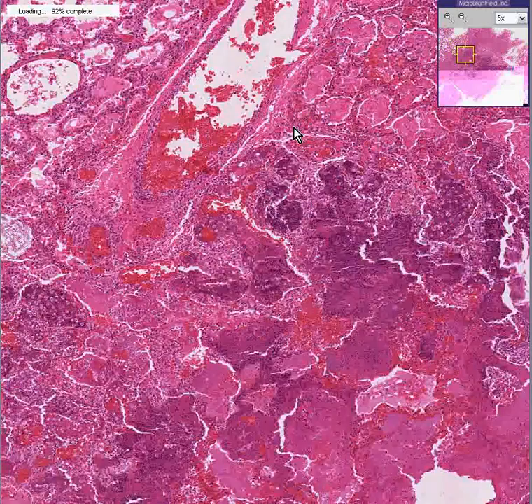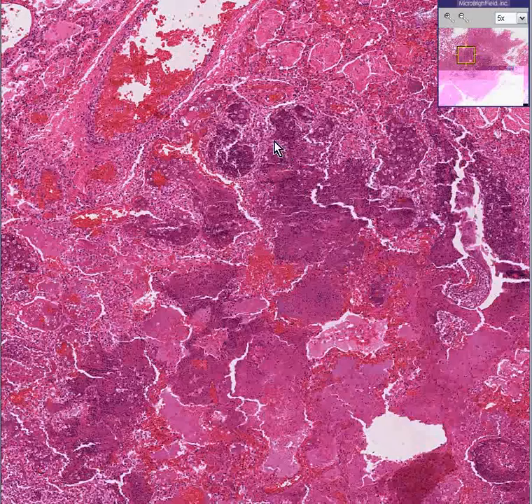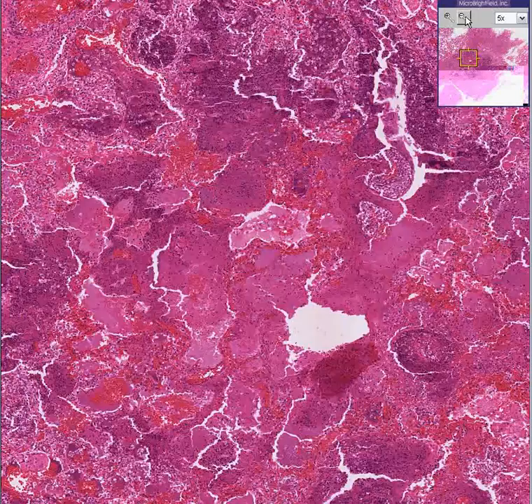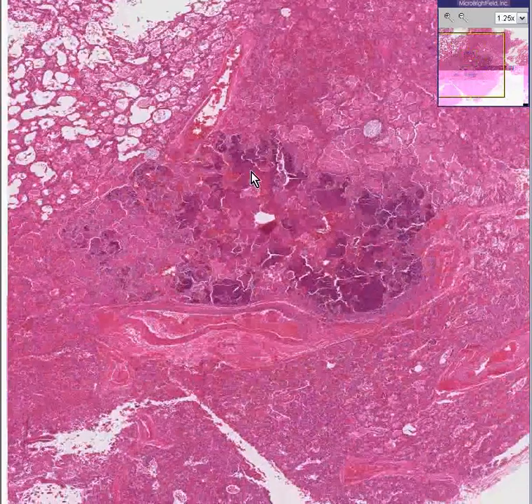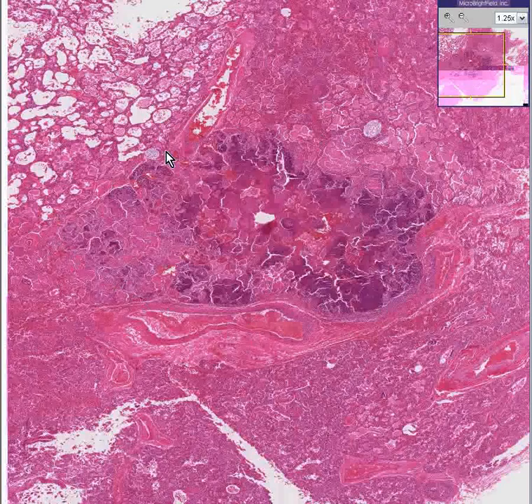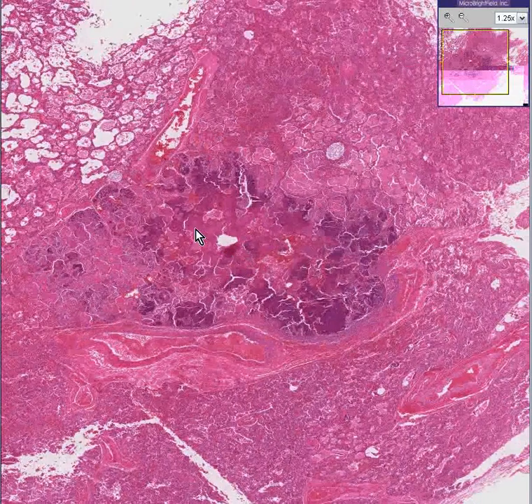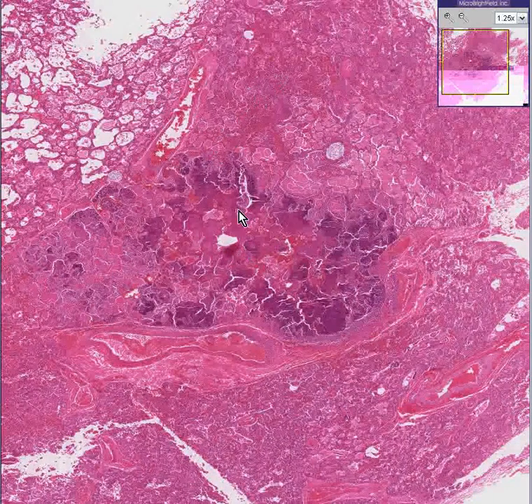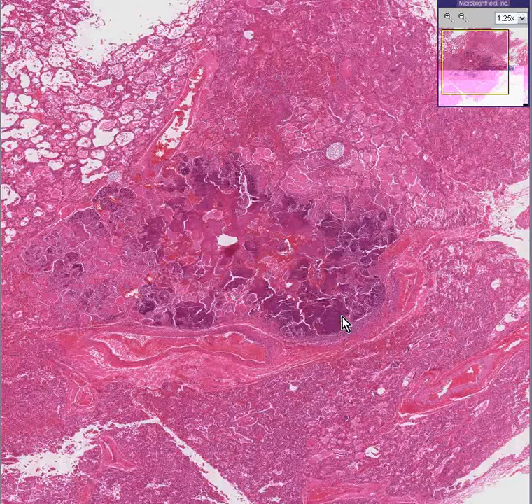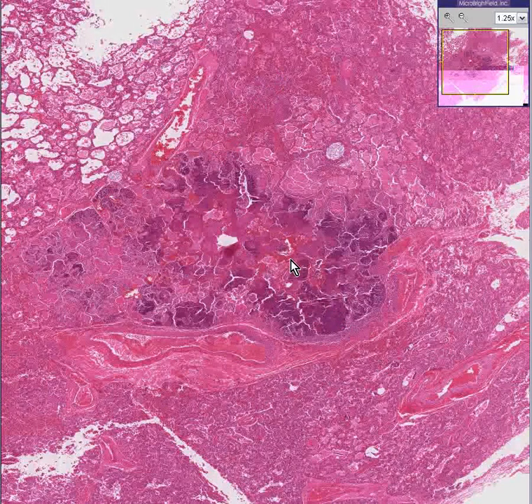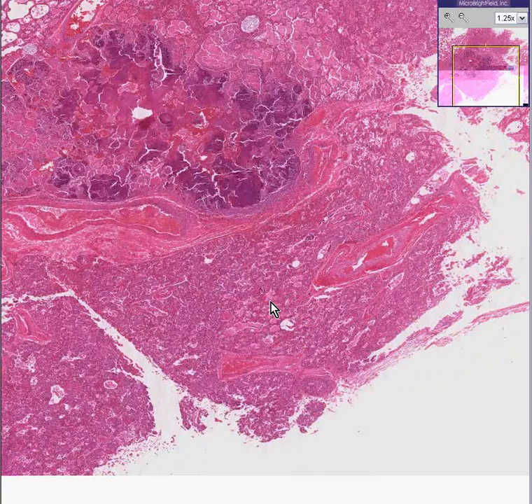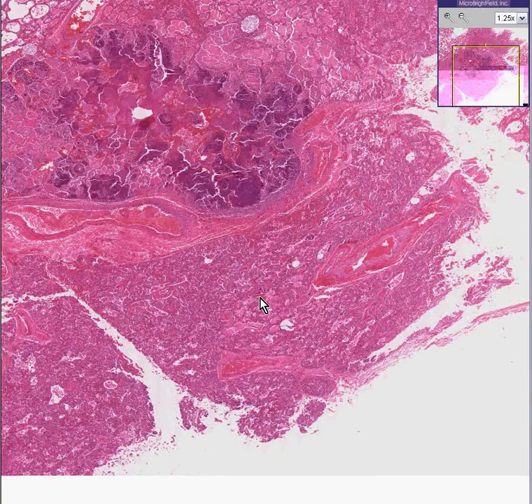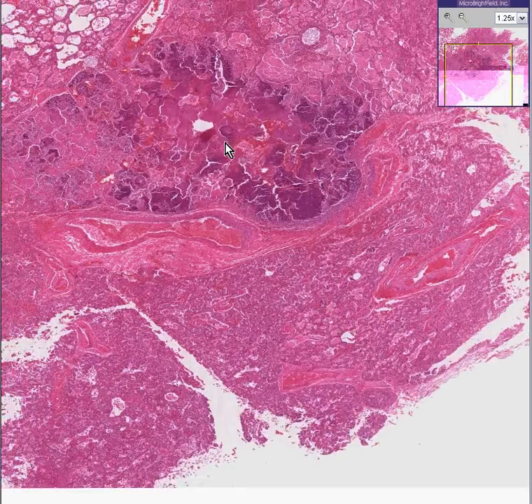In addition, in the middle portion of the specimen, you could almost instantly recognize the fact that within this lung, we are also dealing with an abscess in which we have necrosis and destruction of lung tissue and infiltrates of fibrin and inflammatory cells. And on the other side of the abscess, again, we have a hyperemic, perhaps edematous lung as well.